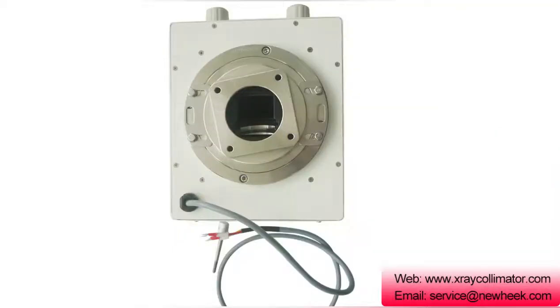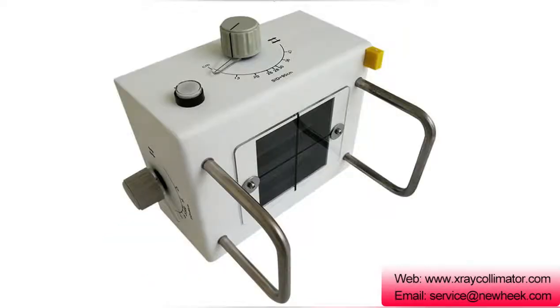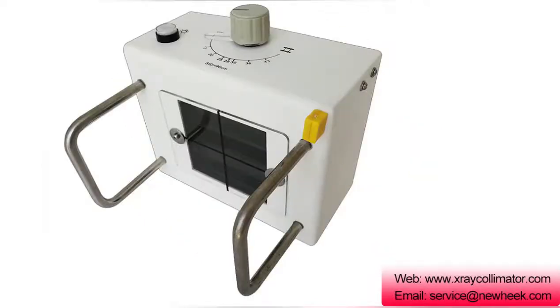The multi-leaf collimator, MLC, now widely used in medical linear accelerators, consists of two collimator groups consisting of thin leaves, each consisting of 40 to 80 leaves, hence a total of 80 to 160 leaves.